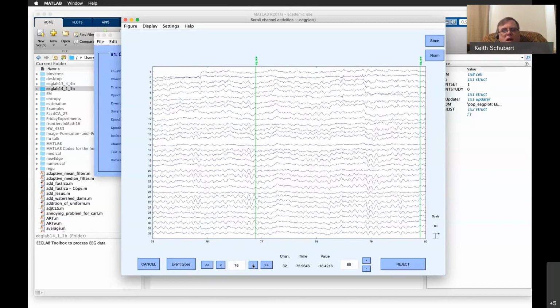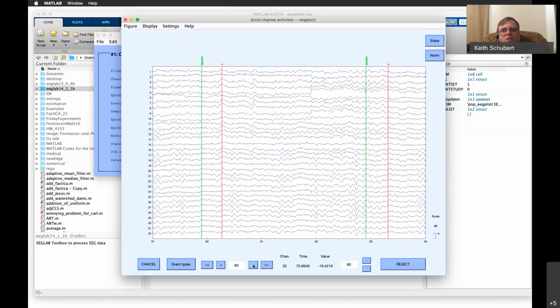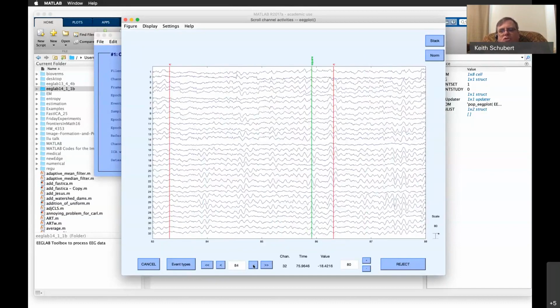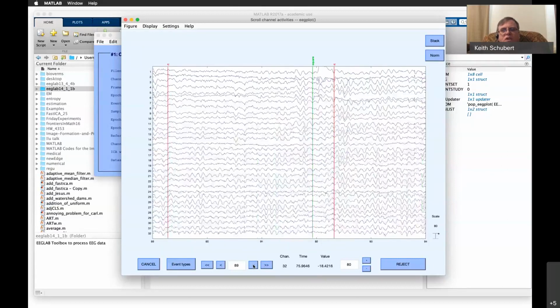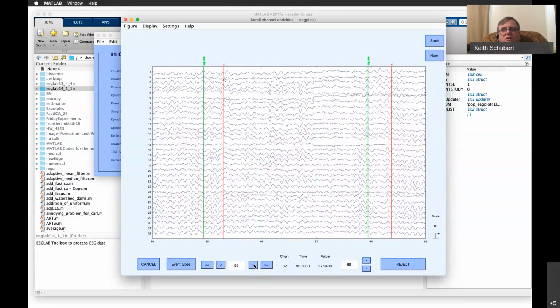Anyway, I don't see any other kind of interesting features. I was hoping we might have some dense squiggles that indicate muscle activity. Usually it's a much higher frequency type of noise, but it's significantly high, so it looks like very thick lines. And then the eye blink looks like it happens in the middle of it, like the square appears and the person's eye blinked involuntarily as a result of that.